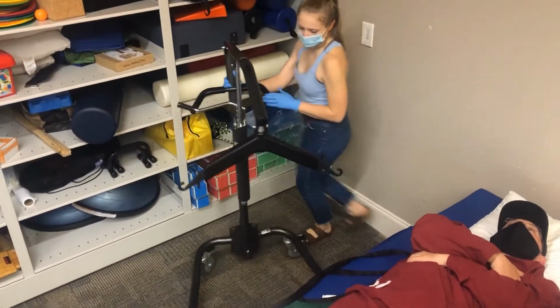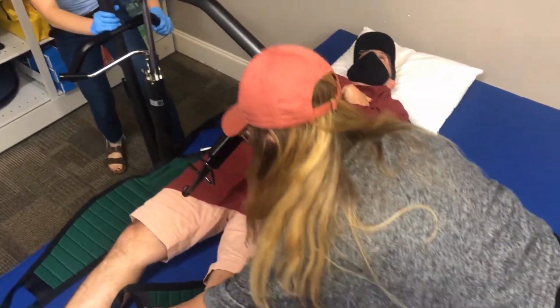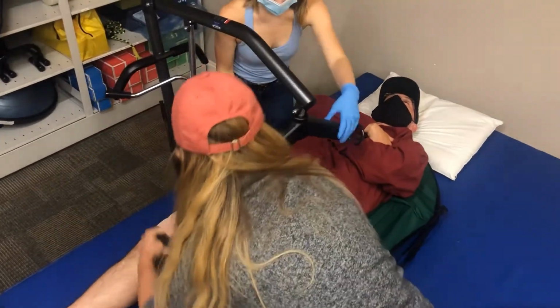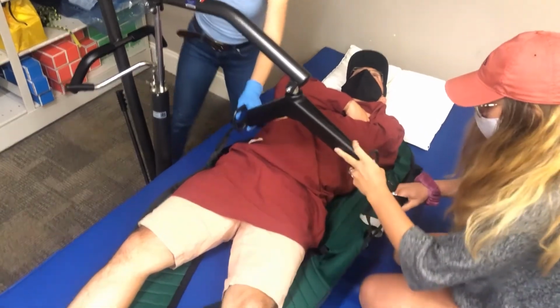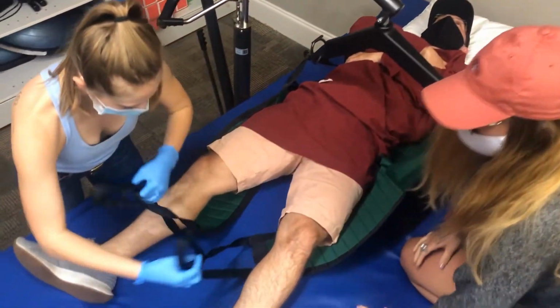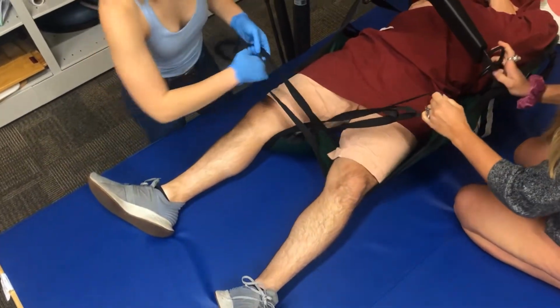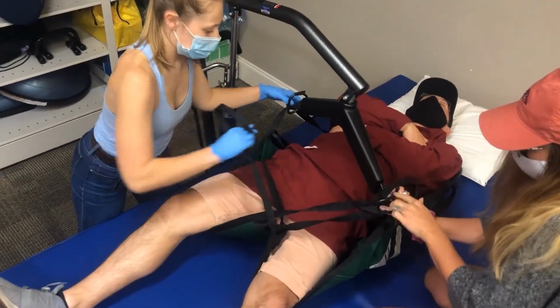Bring the Hoyer lift over and position it so that it is directly over your loved one. Make sure to lock the brakes. Attach the loops onto the Hoyer. Next, you will want to cross the leg straps. Note how the straps get looped through each other. This is very important. Attach the leg straps onto the Hoyer as shown.